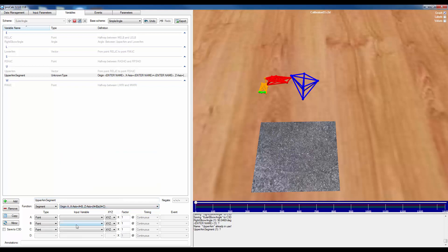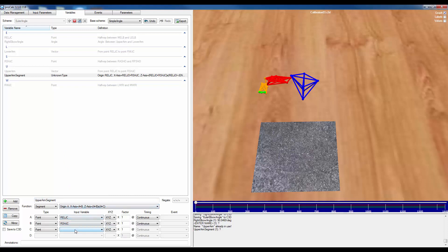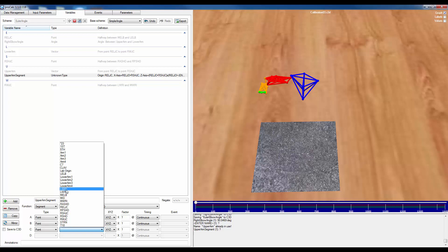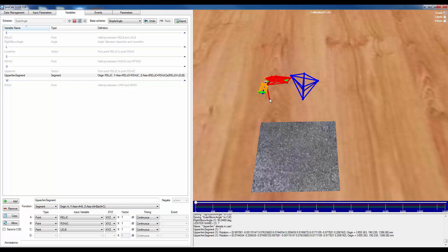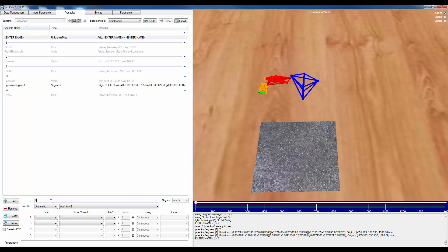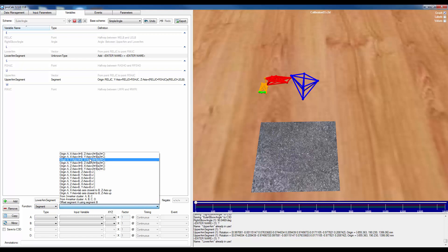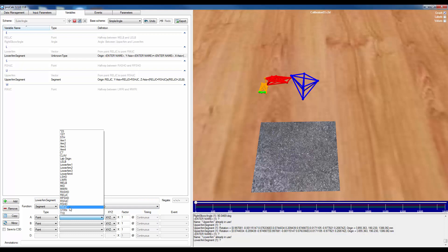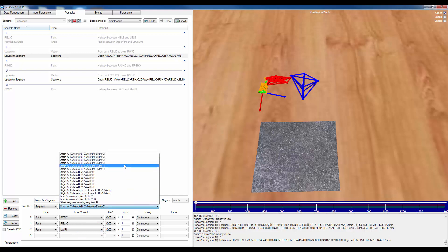I can choose different rotations. The first point is the right elbow joint center going to the shoulder joint center to define the x-axis, and then another vector to the lateral elbow marker to create the second axis via cross product. You can see the coordinate system appear, and if I don't like the order, I can change it using the drop-down. I'll do the same for the lower arm segment — right wrist joint center to right elbow joint center for the first defining line, and out to the lateral wrist for the second. The rotation order can also be manipulated via the drop-down.